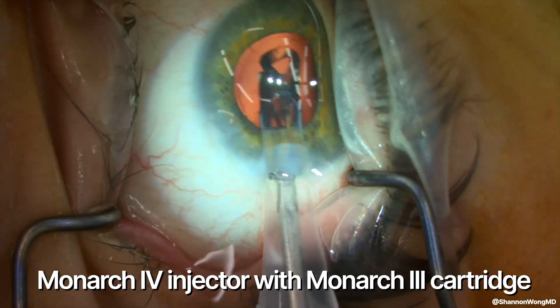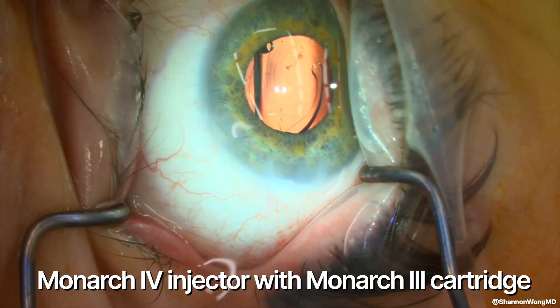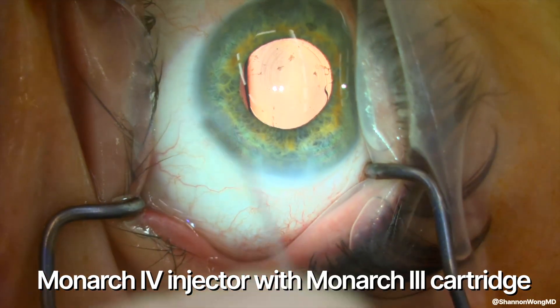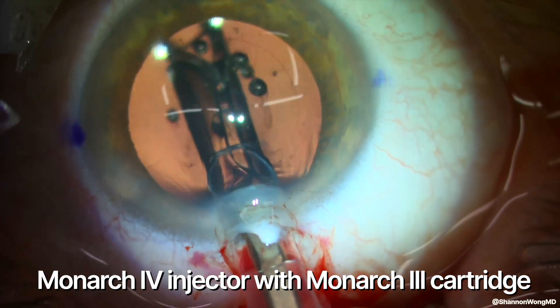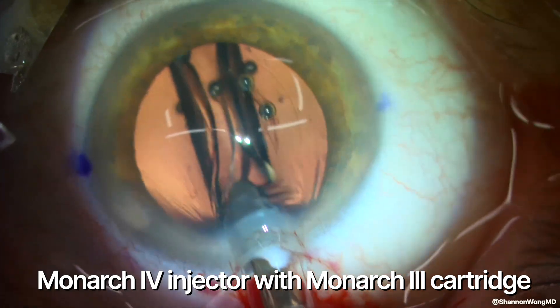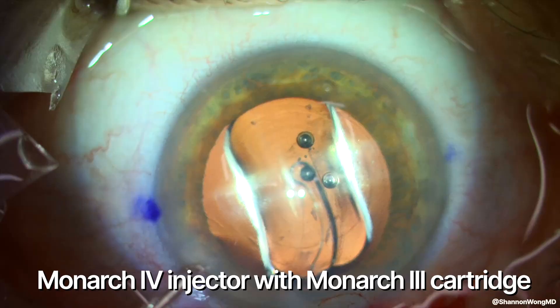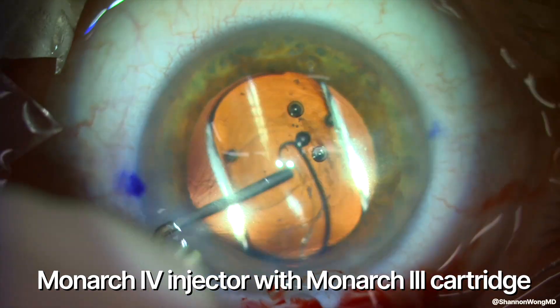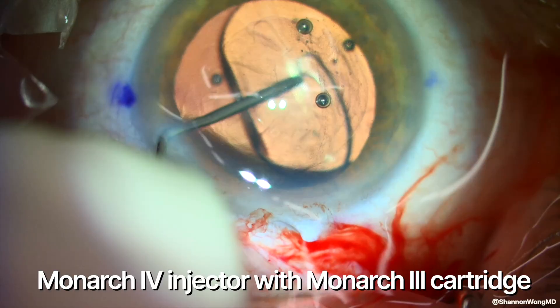Here are two examples of the Monarch 4 injector going through a Monarch 3 cartridge. The lens is inserted into the capsular bag, and the leading haptic goes into the eye in a normal backward-esque configuration and opens normally inside the capsular bag, predictably and in a controlled manner.